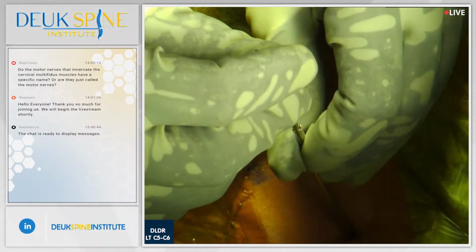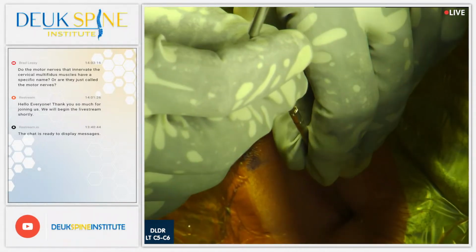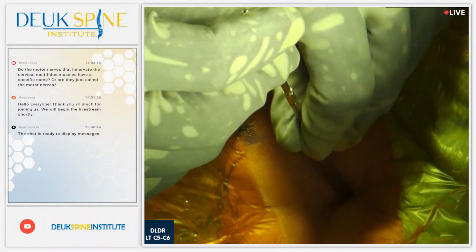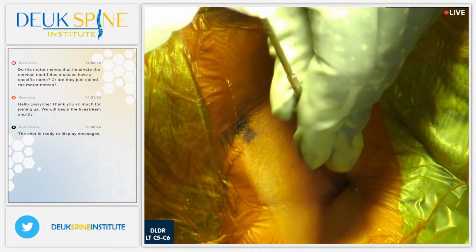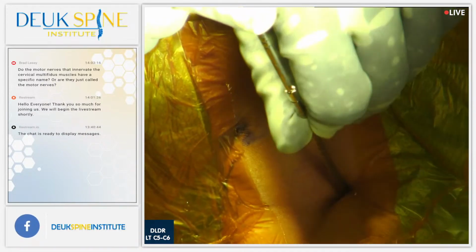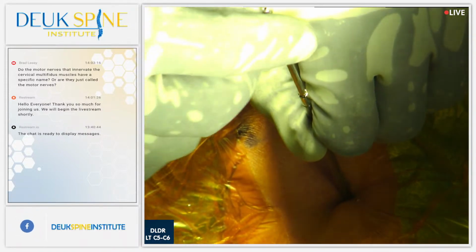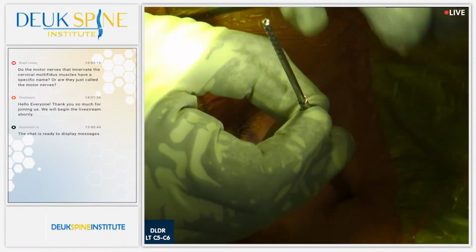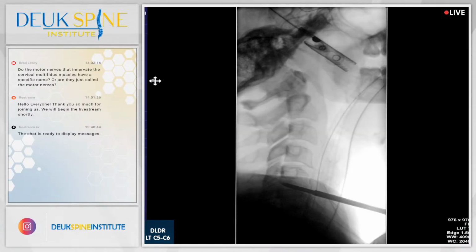She is asleep, completely out with the tube down. She's under general anesthesia. It's the only way we can do this surgery. Let me see. I think my incision is like 3.8 millimeters. Let's see if I can get this down. All right, we're down. So let's go ahead and see if I can keep it down here. Our incision is exactly 4 millimeters because it's just big enough for the tube.